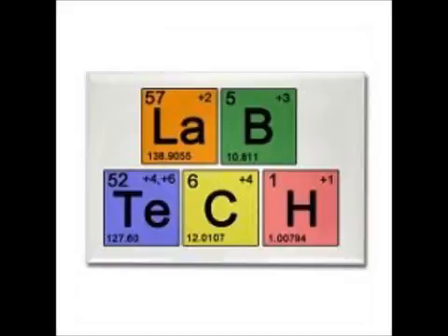If it's truly abnormal and you're not on any aspirin or salicylic acid in any other product, then you proceed to this confirmatory test. So this is an example of a confirmatory test. This isn't a screening test. So we already know with platelets, it's the platelet count and the bleeding time or PFA 100.